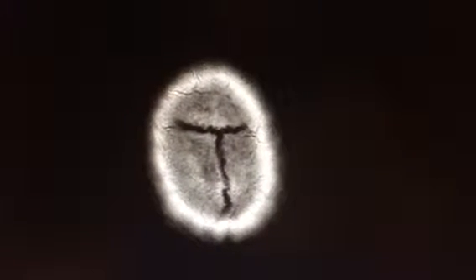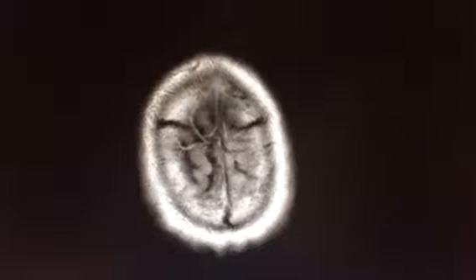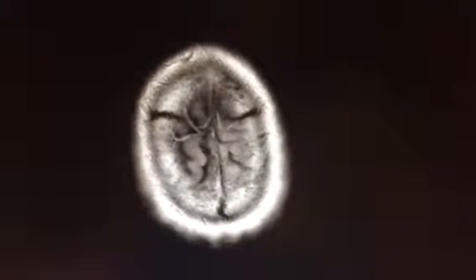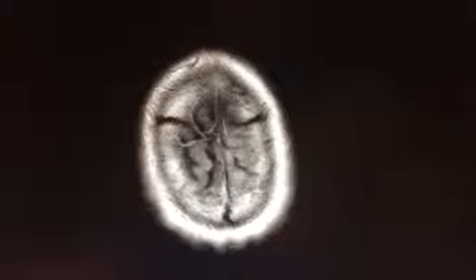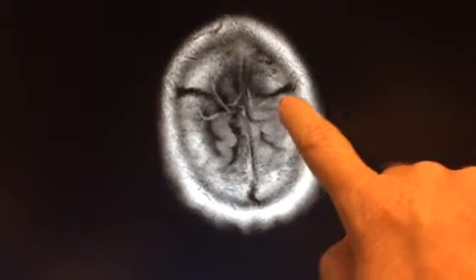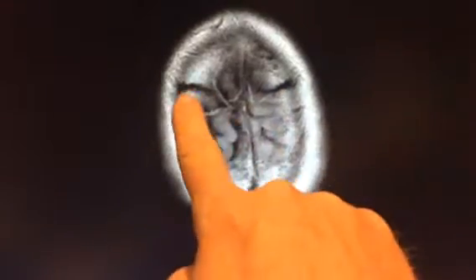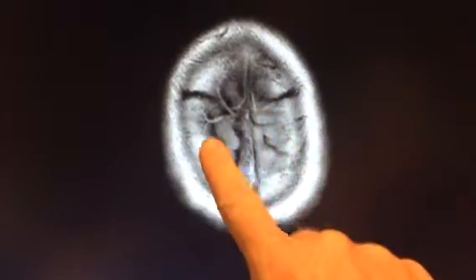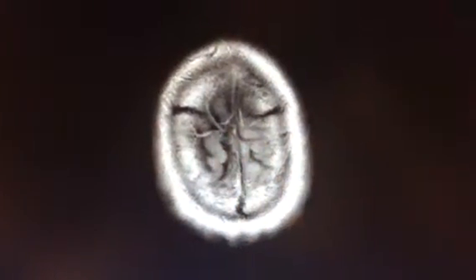So what you're looking at there is the top of his skull. That's where the plates of his skull grew together. We're going to go down into his head, and each time you'll see that the image is a little larger as his head gets thicker in the middle. In this slide, you can still see the forming of the skull on the edges, and then you're inside the skull. This is the top of his head, so you can start to see the brain here.